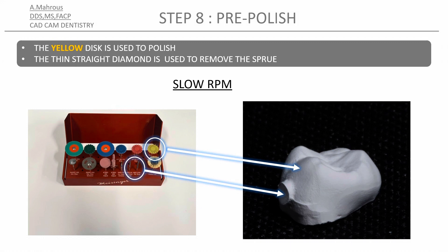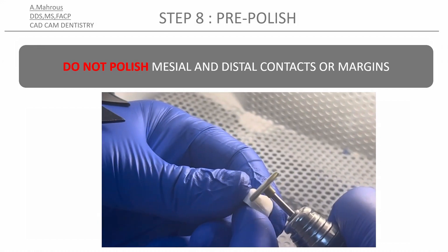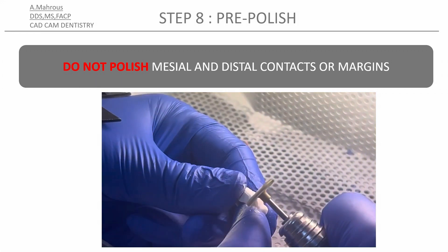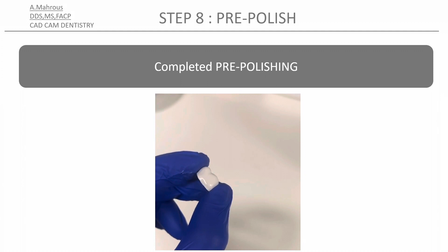Next, you'll be using the yellow polishing disk to bring the surface of the crown to an eggshell finish. This is done on slow speed — be careful not to touch the interproximal contacts or the margins. This image shows you the difference between a pre-polished and an unpolished surface of a crown. The pre-polished surface should have a slightly glossy appearance, especially under the light.